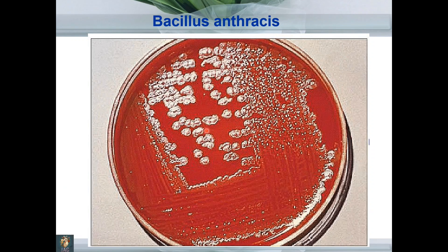Here you can appreciate a blood agar plate with grey-white colonies. If you focus on the shape of these colonies, they resemble a barrister's wig appearance. Grey-white colonies with a barrister's wig appearance grown on blood agar — these are gram-positive rods: Bacillus anthracis.